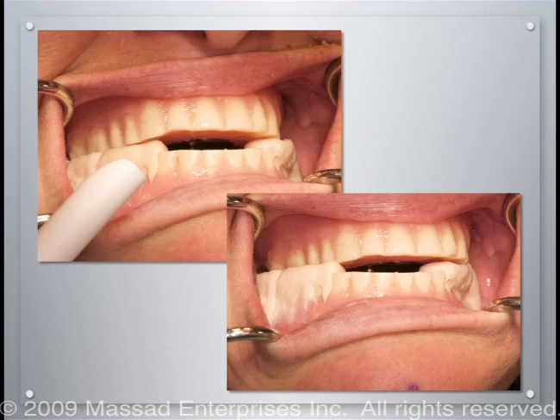However, during the occlusal splint fabrication, we also want the patient to move in a lateral position, both in retrusive and protrusive. In other words, have the patient slide their jaws forward and back and in a circular motion side to side. This will assure that the occlusal topography of the mandibular splint would have taken into consideration all possible movements, whether they are protrusive, eccentric, or retrusive eccentric. This occlusal splint is considered a functionally generated path splint.